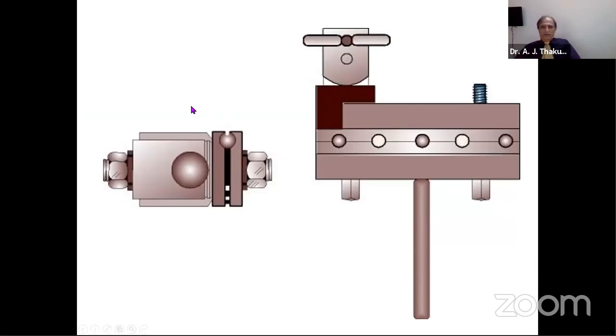This will come to the other element called clamps. As you can see, there are two types. This one will take only one single pin or a screw, while this one will take three or four. This is the design from Hoffman's. This was the original one, and this is from Synthes. I used this in the 90s for quite some time, almost 5-6 years I was regularly using it. The older model, now newer models are very fancy and more efficient as well. But this is quite good.